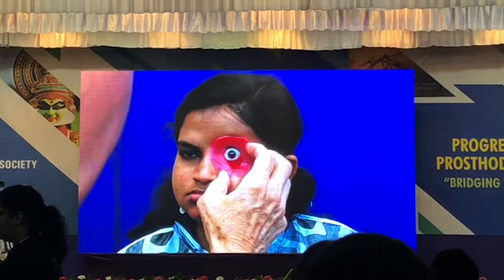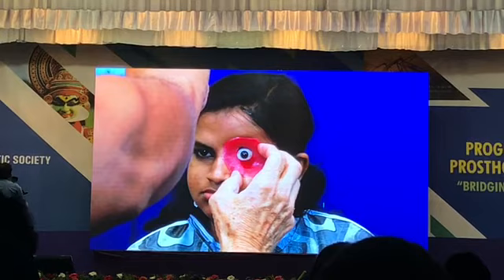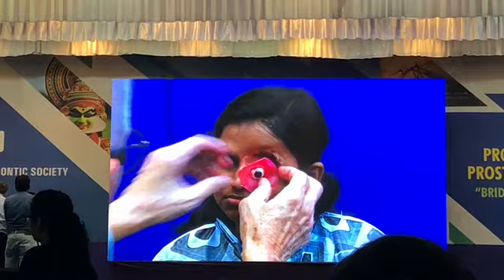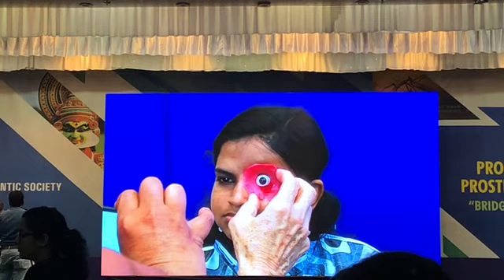Look at me. Okay, shine your light for me, Jacob. Let's get it right here. Okay, still looking up a little bit. See that light is a little bit on the bottom side? You see how you can see that? You can see it right there. Okay. Okay, let's shine the light. Now that's looking pretty good, isn't it? Can you see that, Jacob?